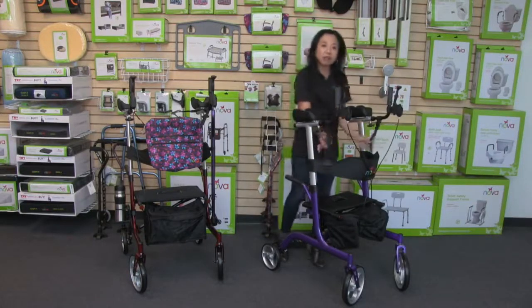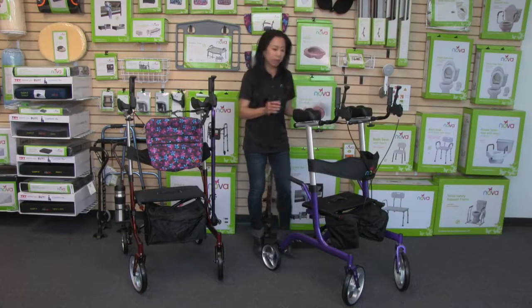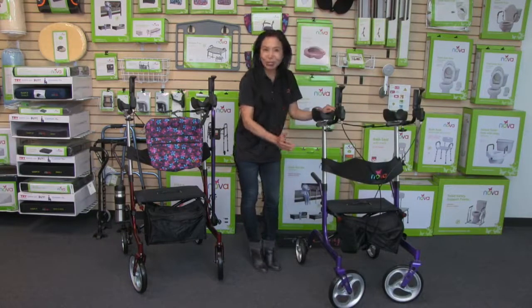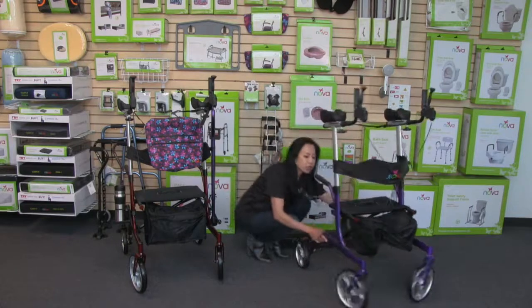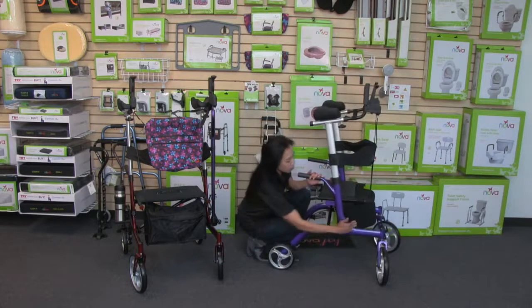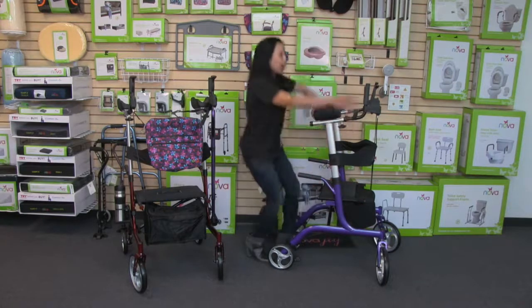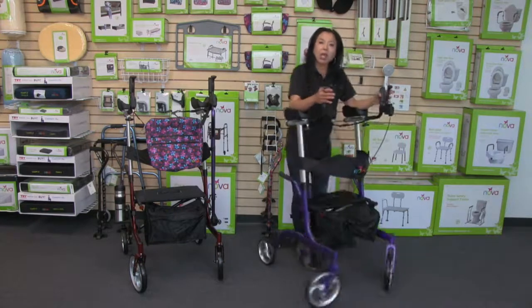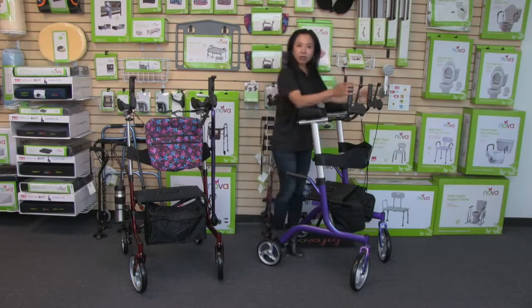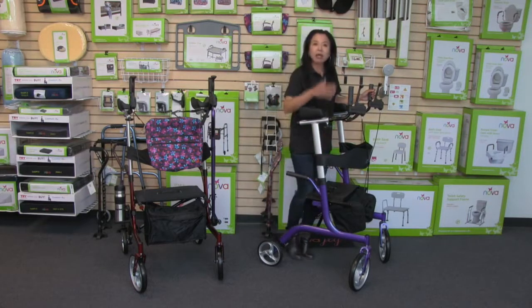While it only weighs 20 pounds, this is an incredibly stable and durable rollator because of the base. It has very durable all-terrain wheels — 10-inch wheels in the front and 8-inch wheels in the back. The frame is designed so the front wheels and the front of the frame have an extended forward position, so when the user leans forward for momentum, that front-forward design keeps the center of gravity stable and keeps the user safe when going over bumps, curbs, or grassy terrain.